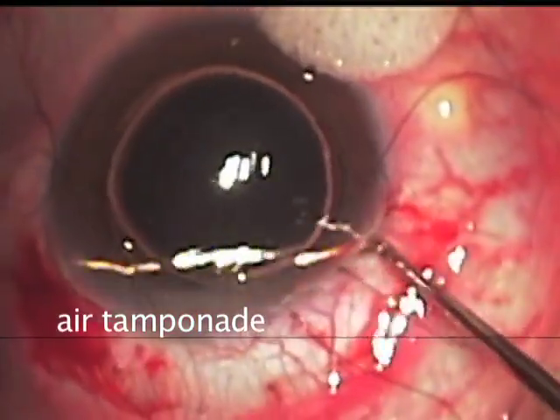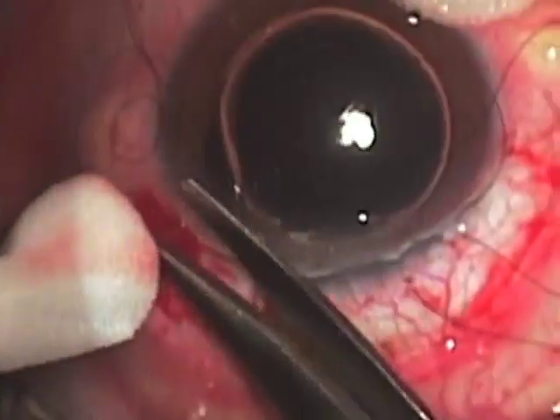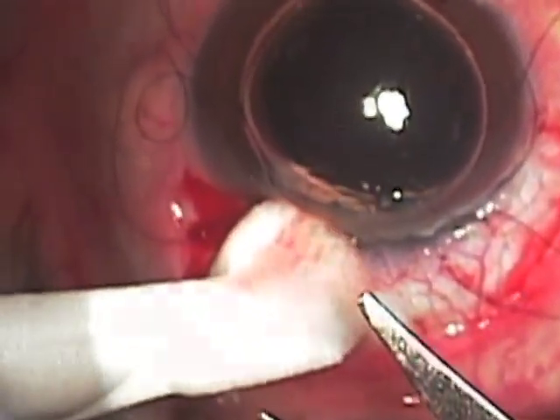Air is used to tamponade this vitreous and the large amounts of it that are coming forward are swept with a blunt spatula, and some additional vitreous removal with scissors is performed.